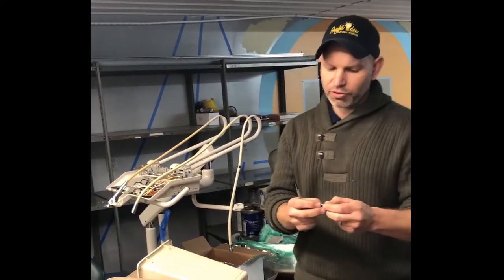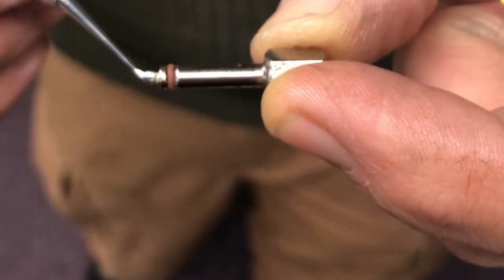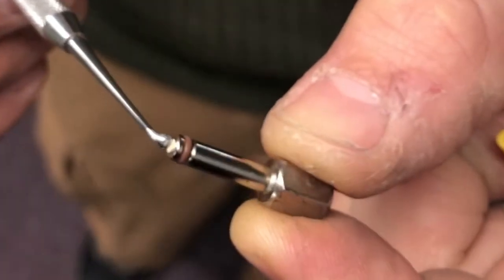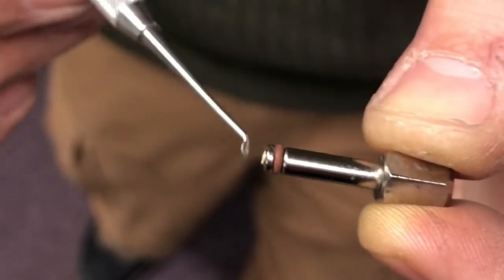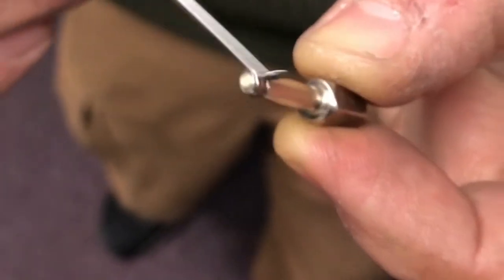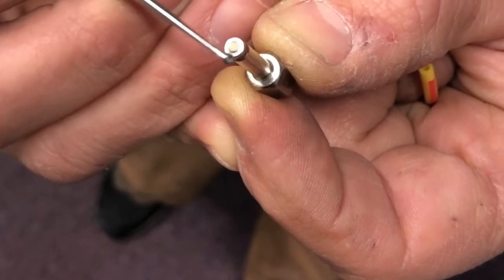Now, if you have a screw that breaks, what you're going to end up with is a screw that looks like this. And the actual breakage is going to happen right where the O-ring is, basically where it narrows down. Now the opposite side of this is going to have a small shaft, and it's going to have a wider end. Now that's the part we're going to be extracting. The beautiful part about this is that what's left is that little small shaft, and it gets wider.